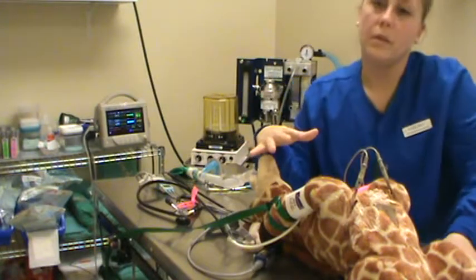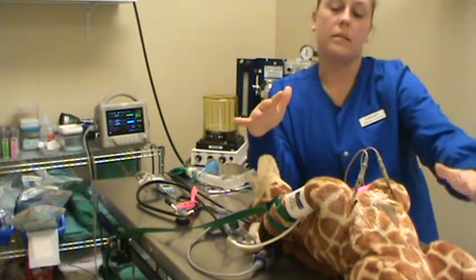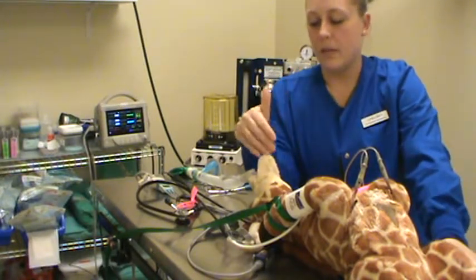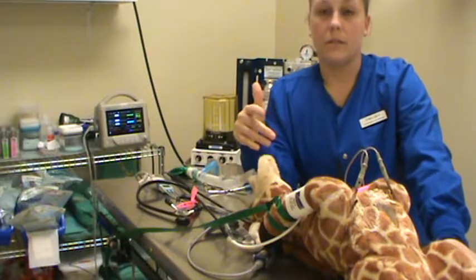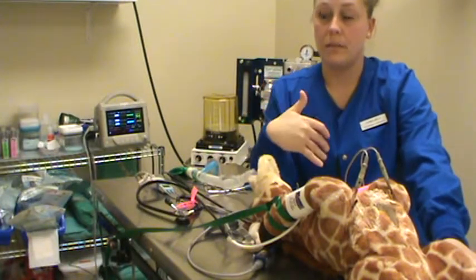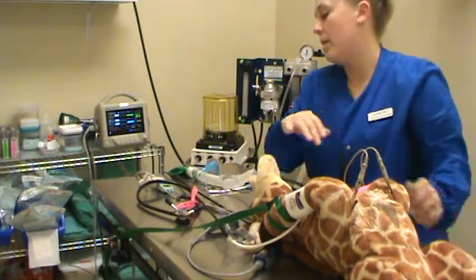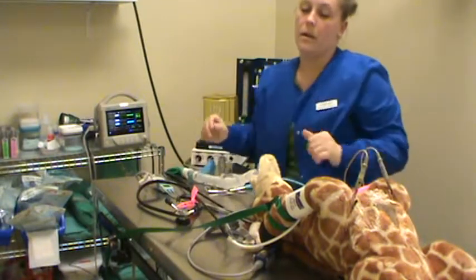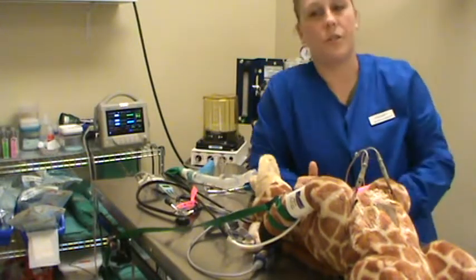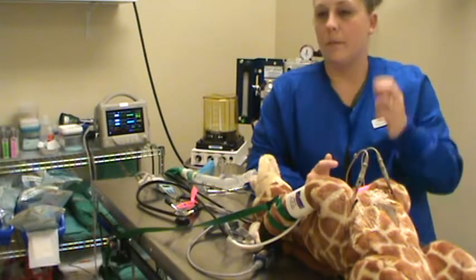We need to be really careful with this stage because all the muscles are really relaxed. The ability for them to maintain respirations is also in danger because their intercostal muscles are really relaxed, if not paralyzed, and they're going to need help breathing. So you're going to assist them with breathing and bagging them, and make sure that they stay oxygenated during this plane.